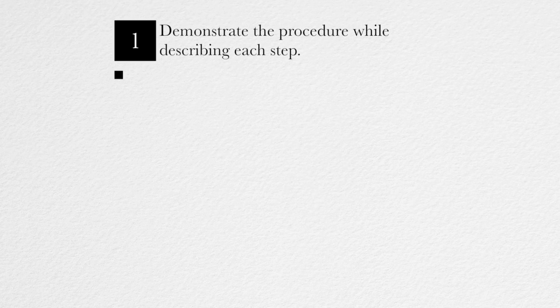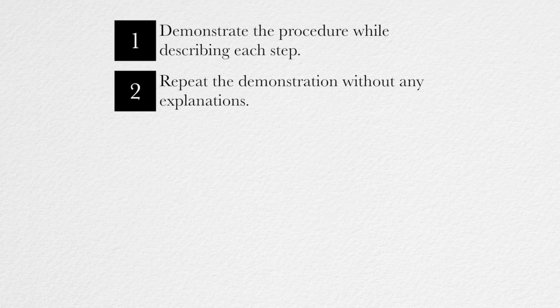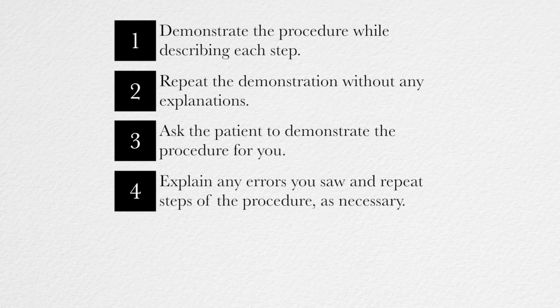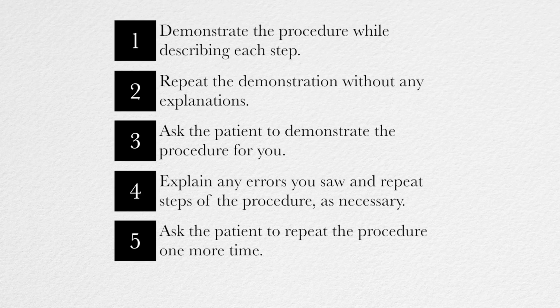Now, before we get into the finer details, here is an outline for your teaching encounter with your patient. Demonstrate the procedure while describing each step. Repeat demonstration without any explanations. Ask the patient to demonstrate the procedure for you. Explain any errors you saw and repeat parts of the procedure as necessary. Ask the patient to repeat the demonstration again.